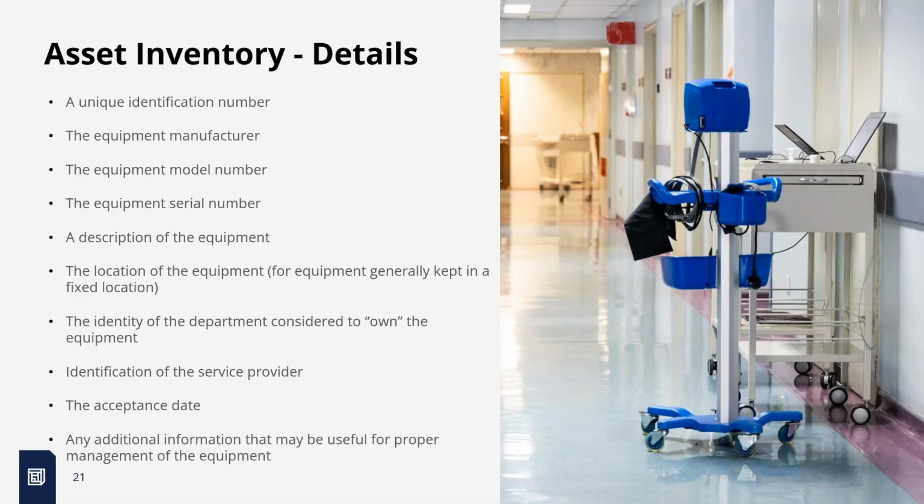That's more of a recommendation on the side, but how does the technician get to the information they need quickly to maintain that equipment properly through procedures, or if you have to do OEM, original equipment manufacturer instructions, or if you're doing your own instructions as part of your AEM, alternative equipment maintenance policy as well. I think there was another AEM presentation earlier today, if I'm not mistaken.